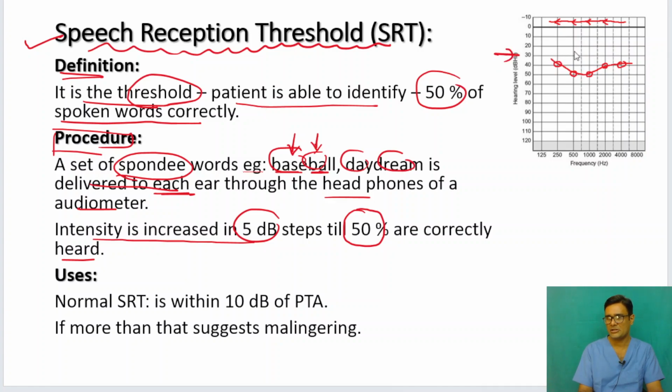Okay, so here is an example. This is a patient with conductive hearing loss. You always take 500, 1,000 and 2,000 Hz. These are called the speech frequencies, right? So 500, 1,000 and 2,000, say 50, 50 and 40. So it becomes 140 divided by 3, approximately 45 decibels of hearing loss this patient is having, conductive hearing loss, because there is an air-bone gap.